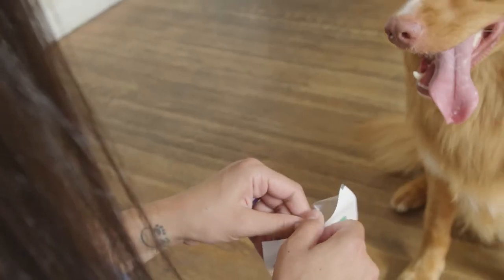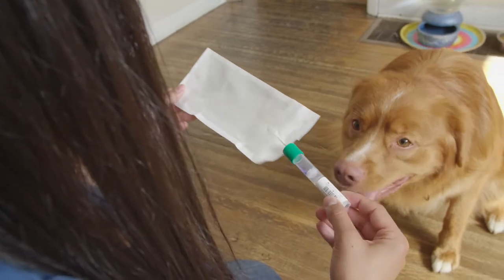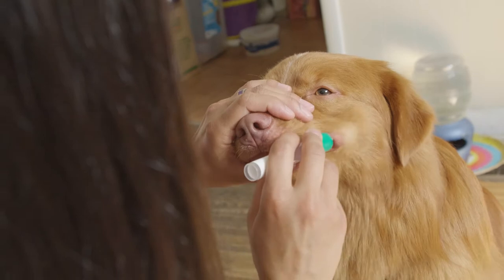Open your sampling kit and carefully remove the swab by holding the tube. Don't touch the swab tip with your hand. Place the swab tip between your dog's cheek and gum.